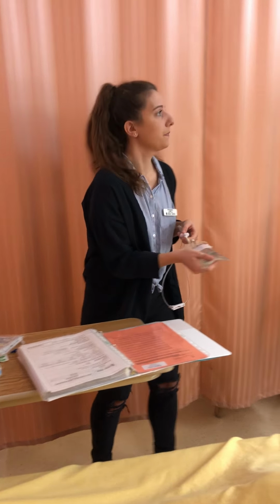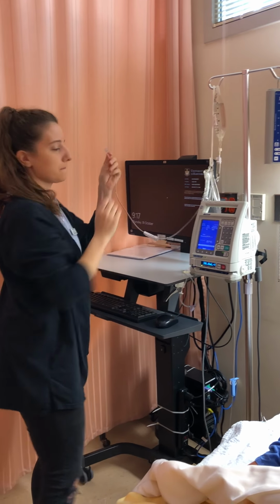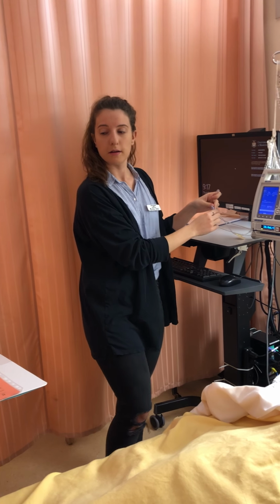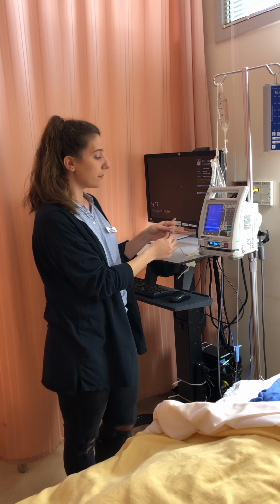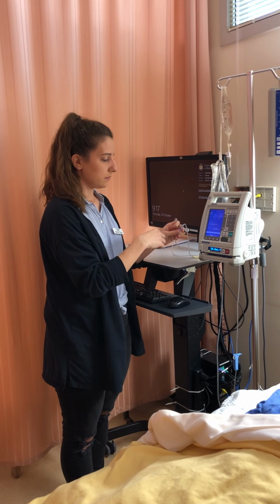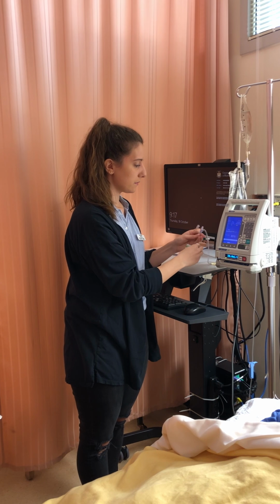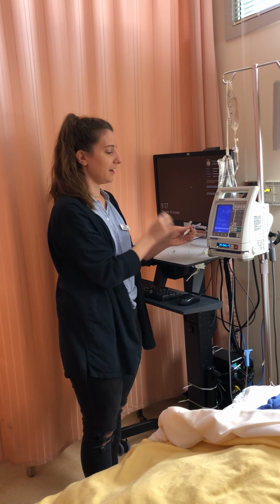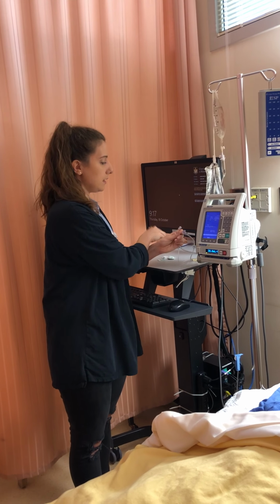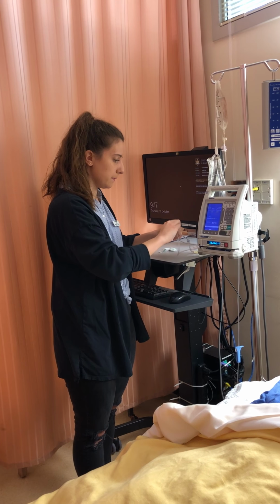Okay. I have my label here for my tubing. So it has my initials, date and time. So I'm going to swab the port above the pump, because mine will be going through the pump. This is done. I'm going to come back with 3 milliliters. I'll be regulating it. So swabbing for 30 seconds and letting it dry for 15. Using sterile technique, I am connecting it here.